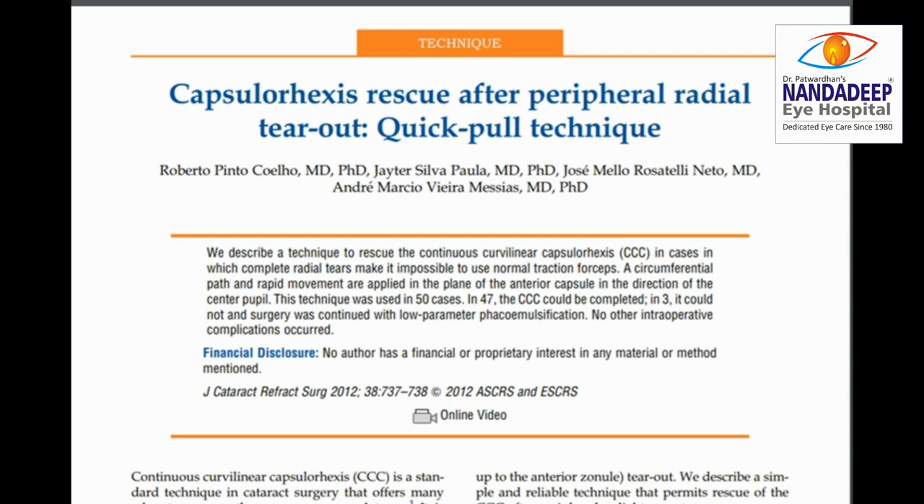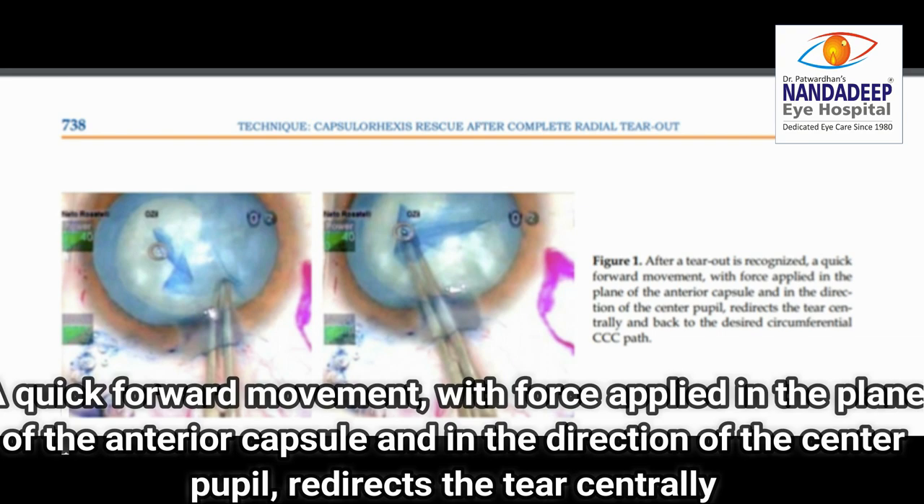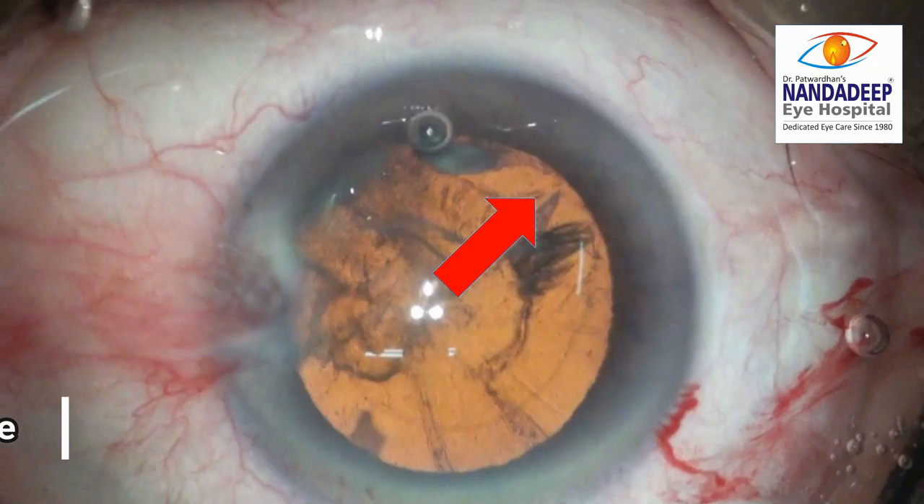We demonstrate the quick pull technique described for the cases of peripheral radial tears. The flap is pulled with a quick traction in the direction of the center of the pupil, which redirects the tear centrally.